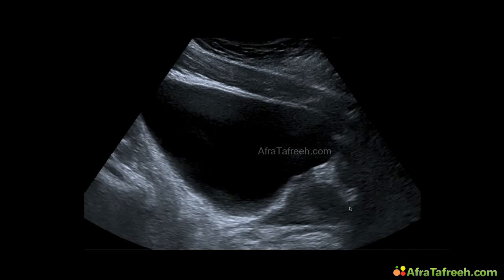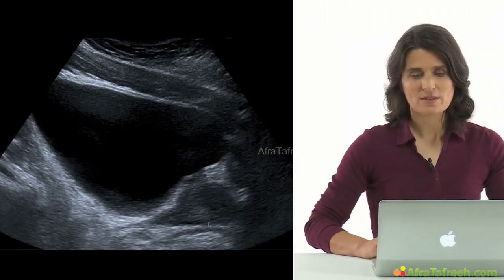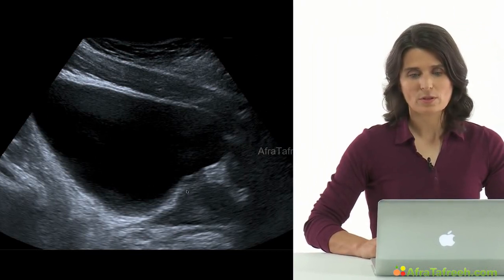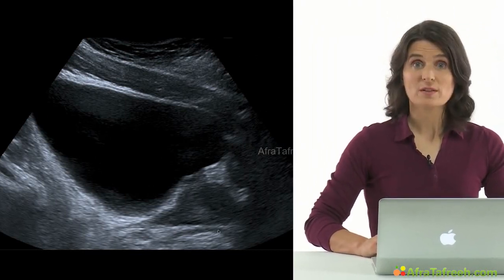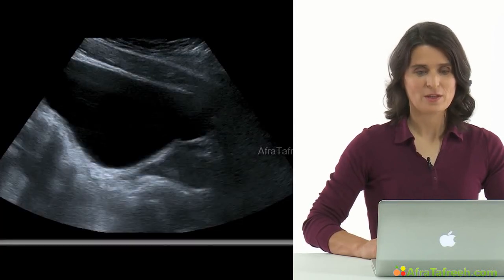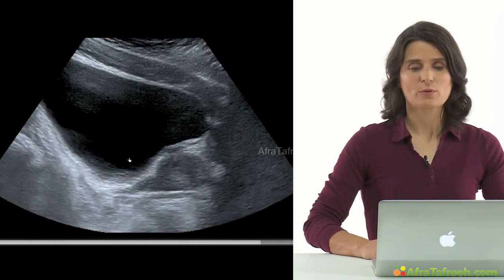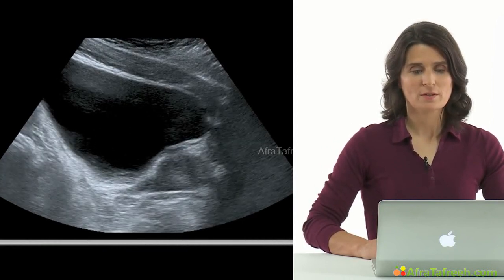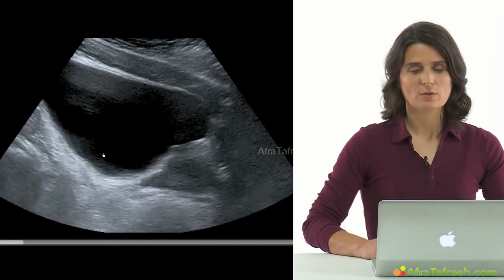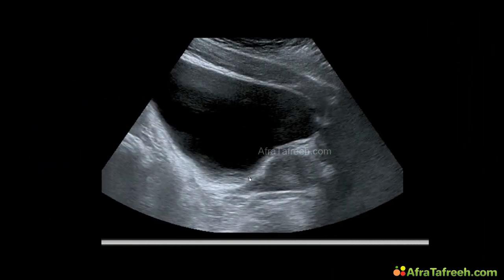And here, caudally, inferior to the bladder, we can see this round organ over here, which is a prostate in a longitudinal scan. Urinary bladder over here, and the prostate. So here in the video clip, again, of course, we perform a scan through the whole organ from side to side, easily to detect a reasonably filled urinary bladder and a healthy prostate in a longitudinal scan.